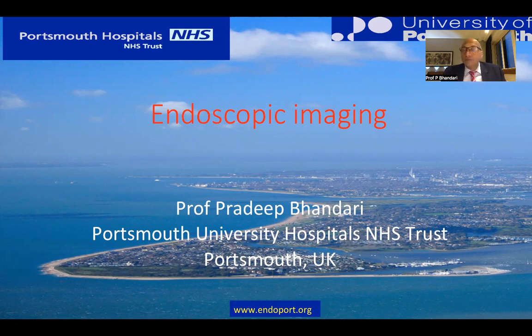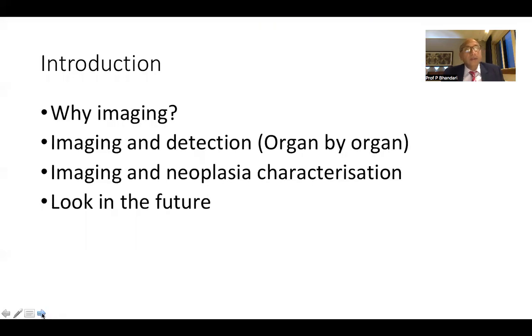I will quickly go through aspects of endoscopic imaging, and we can talk about the need for endoscopic imaging. And these are the four headings under which I will go through this talk and go through most of the imaging technologies organ by organ.